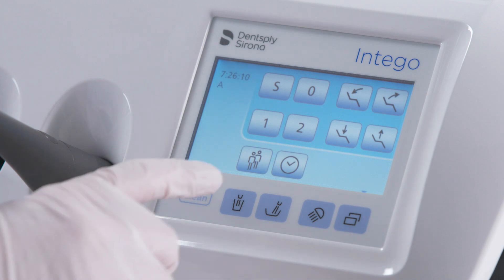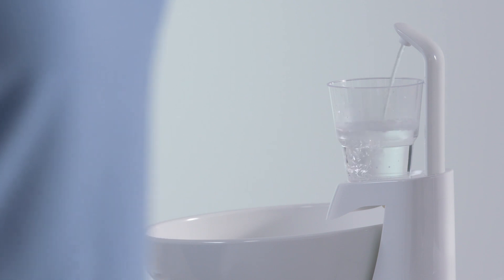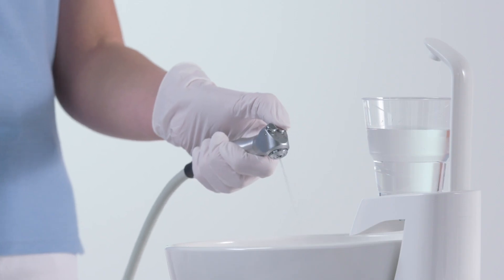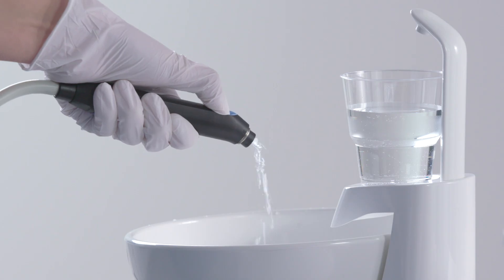If the purge option is not provided, the water lines must be flushed manually. Press the tumbler filler three times. Hold the syringe of the dentist and assistant element over the cuspidor and press the water key for at least 20 seconds.